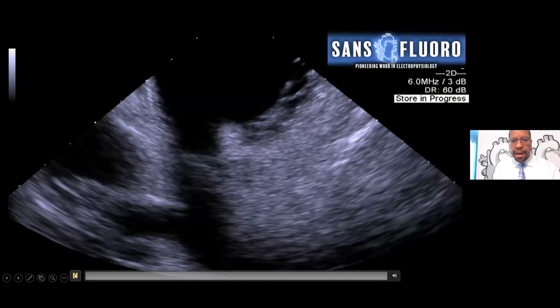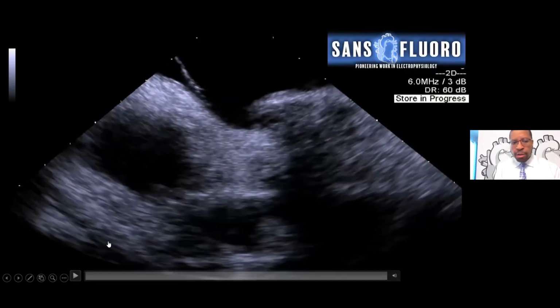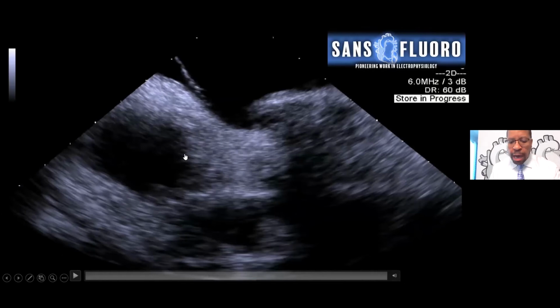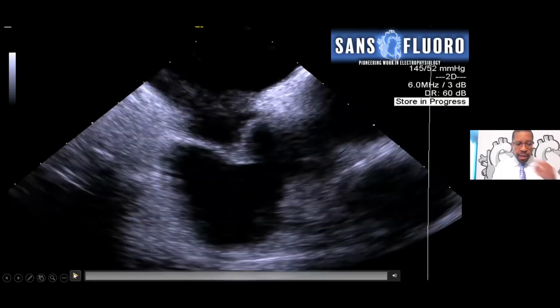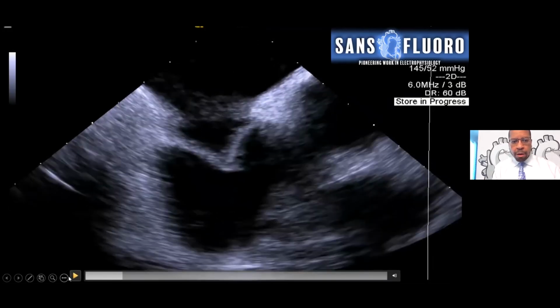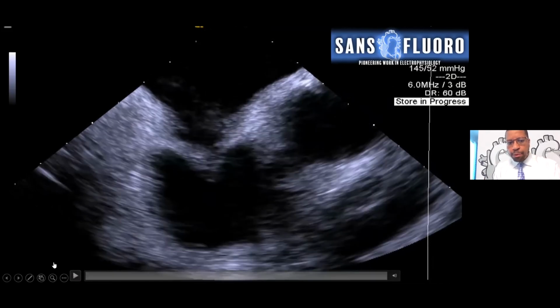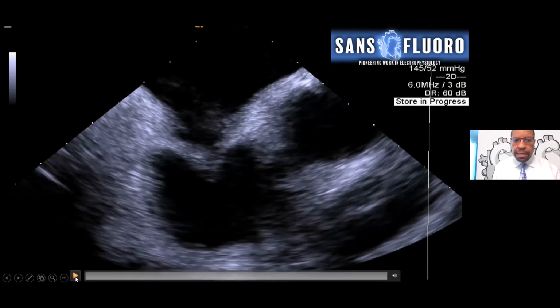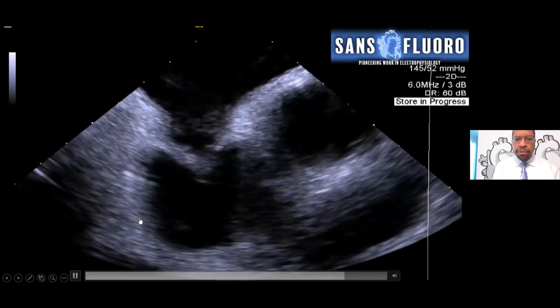Now, in our next slide, you can see where we're actually pulling it back. So this is one of the first examples that most operators should get to in learning how to do this. And as Dr. Kazemian said, when you drop down into the actual foramen, what you should aim toward is the veins if you're doing a PVI. Now, if you're going to do a VT ablation, you want to look anteriorly, bring in the appendage over here, or actually aim toward the mitral valve. And he did an excellent job of showing that.